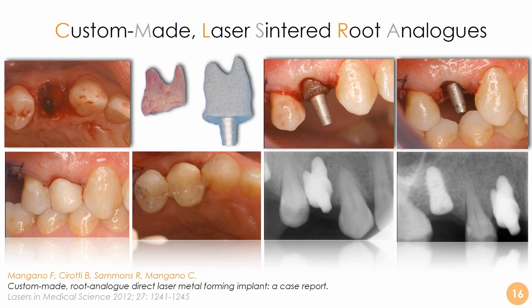There is an attachment. Of course, there is a lot of discussion in the last years about surfaces and perimplantitis and these things, but I have to say in these very few cases made, we didn't have so big trouble. Only one of the implants at the end, after several years, one of the 15 implants placed had been lost for perimplantitis after many years. So I have to say that globally it worked, even if we have very few cases, and of course there's a need for more studies, but this is a very particular solution, and obviously sometimes it's much easier to place a standard implant and definitely less expensive.